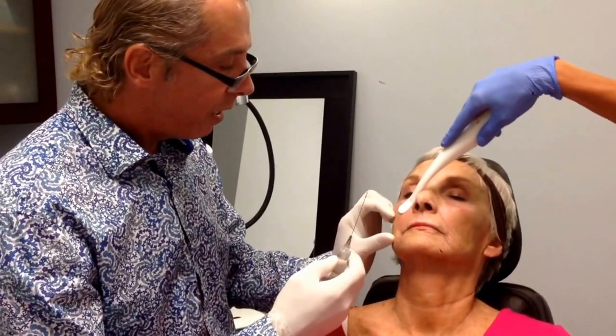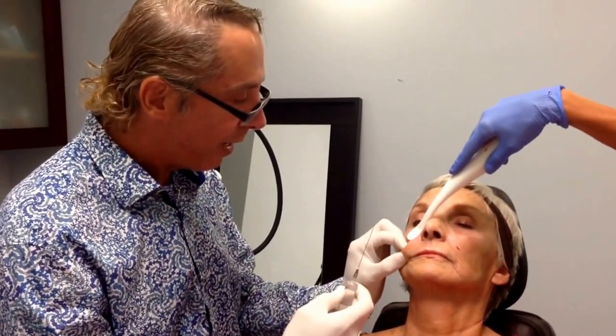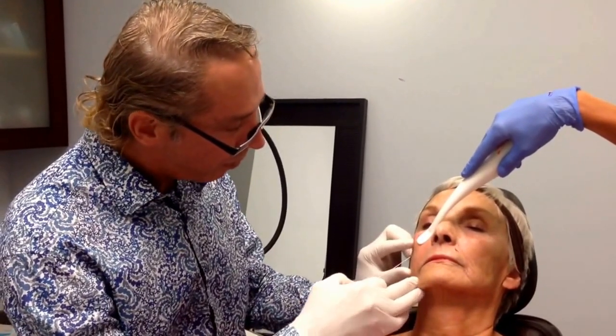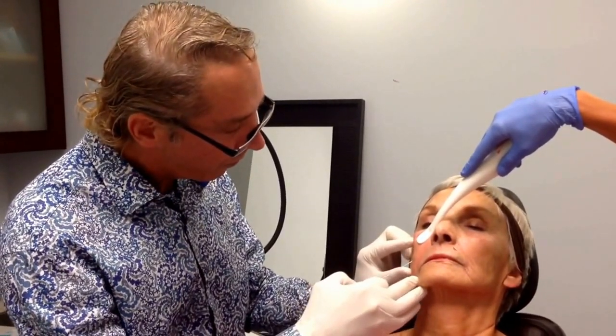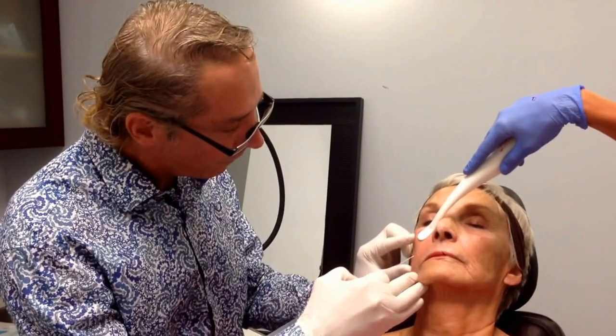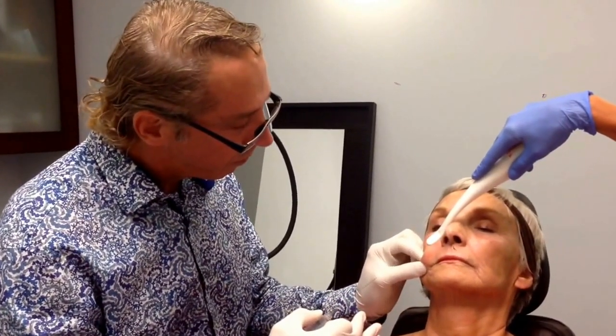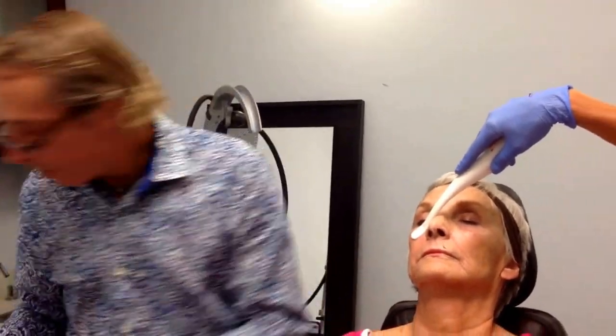She's pretty good — she's not bleeding. So I'm going to find this hole that I've created. Sometimes you have to do it one-on-one. Here's one more hole.